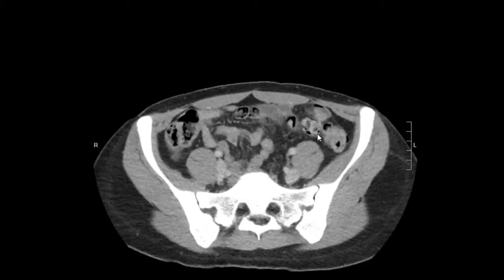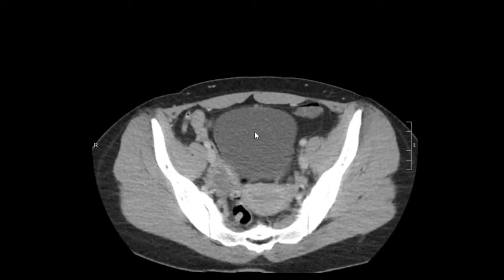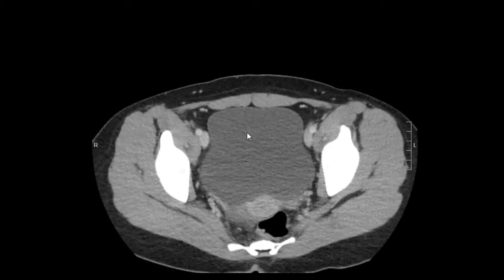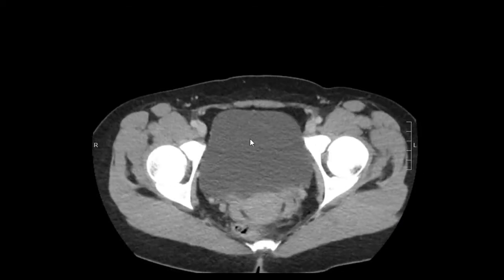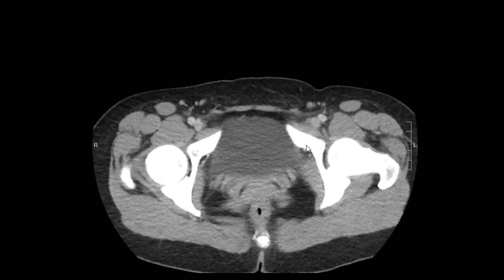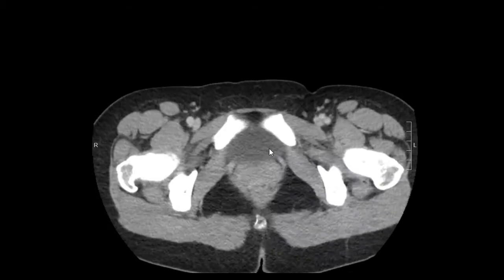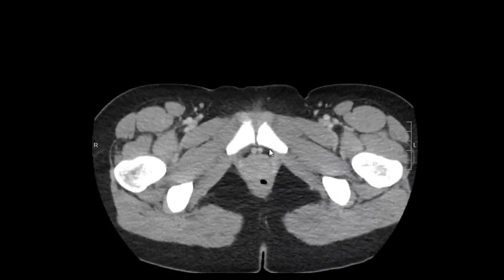It's not dilated, so it's most likely normal. The bladder is distended with urine. There's no abnormal wall thickening, no blood, nothing abnormal here.